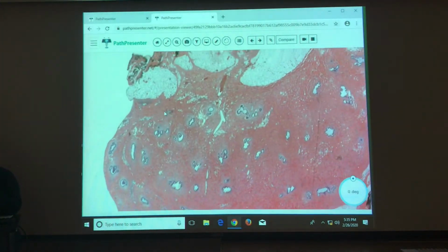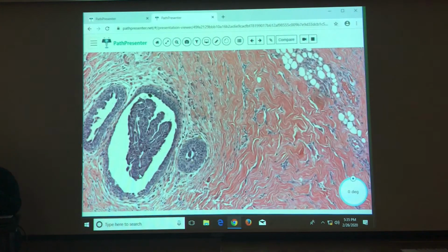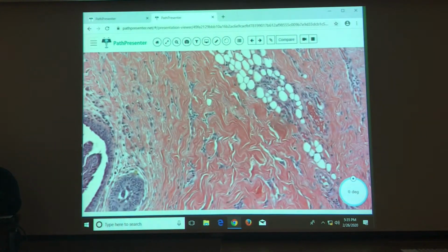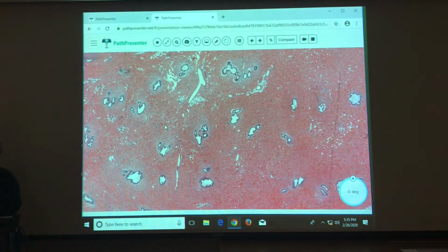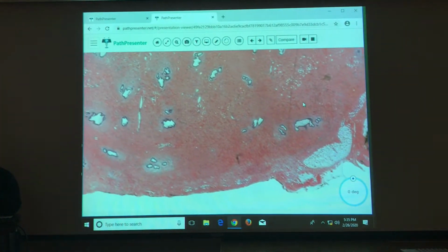Alright, so if we think nodular lesions that look pretty benign, really fibrous, in a man, you can see this in women too, but this is the most common lesion in men. Gynecomastia? Yeah. So this is a lesion that's been sitting around for a long time.